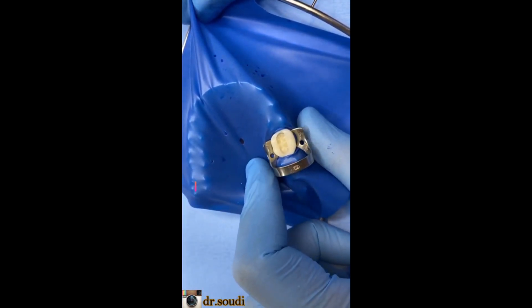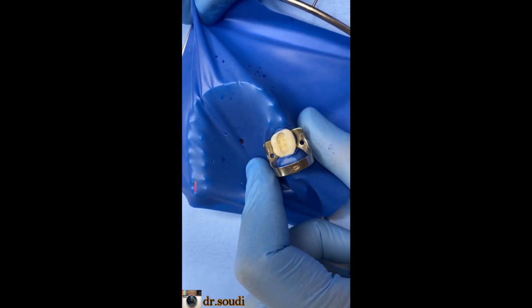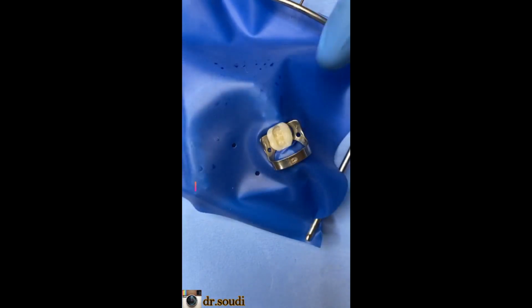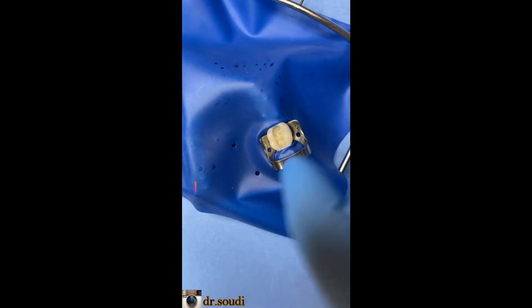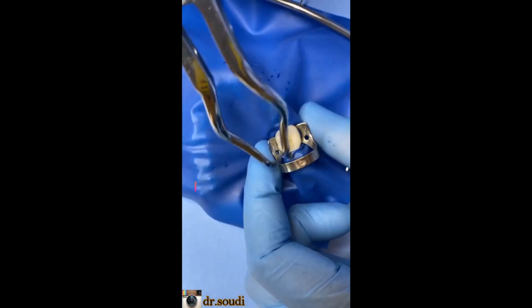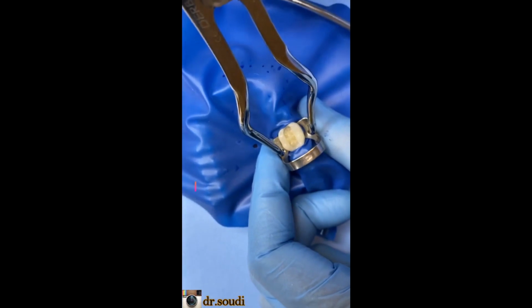If you need to do a single tooth isolation for an access or for your cavity. For me, I don't usually use this one because I need the other teeth to make the anatomy I need. So I need quadrant isolation. So the first one, you can use the clamp first and then the sheet. There is another technique for the single tooth, yes.